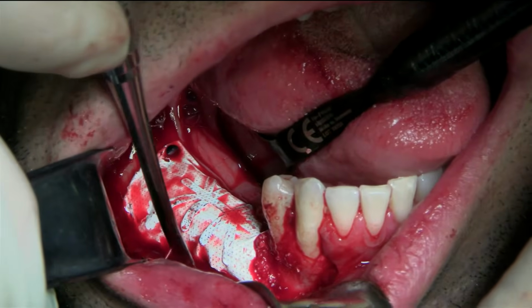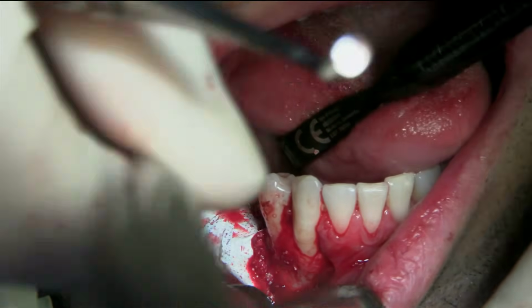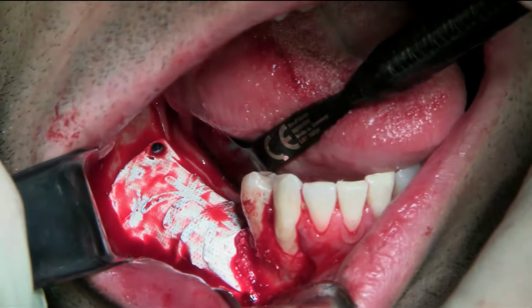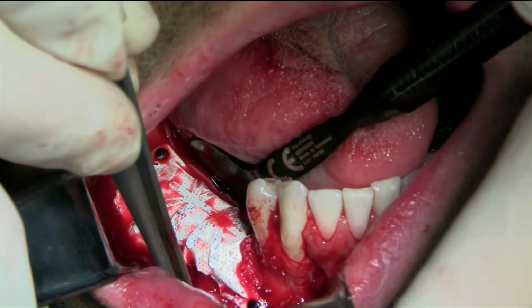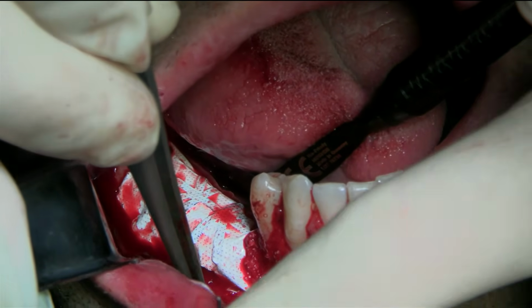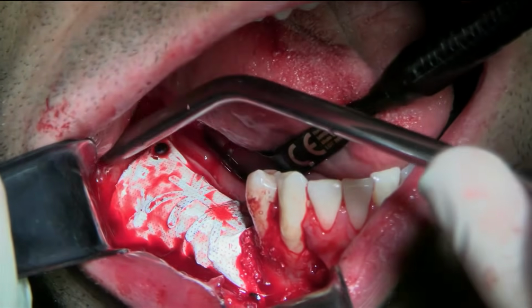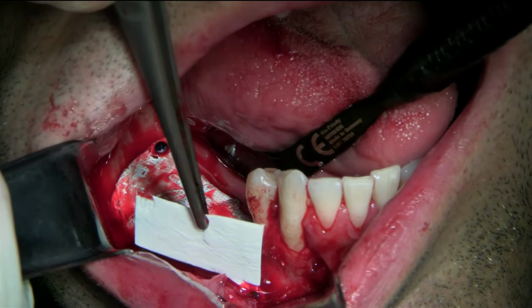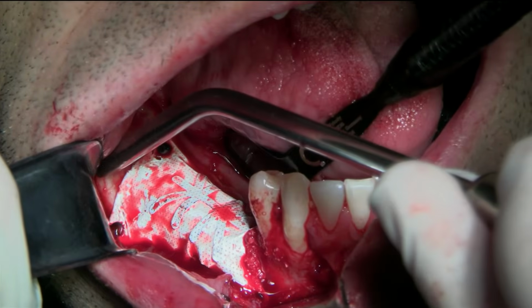Okay, now suction there. Okay, you hold this one. So that's your collagen. So you're going to cut it a little bit. No, it's not worth it.